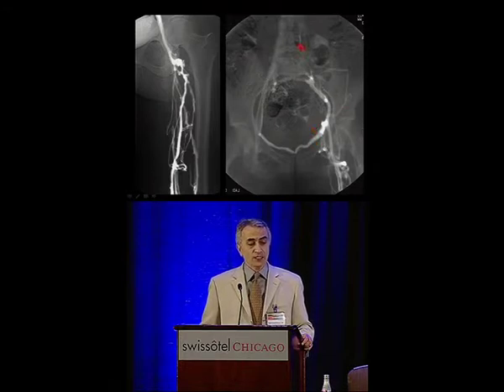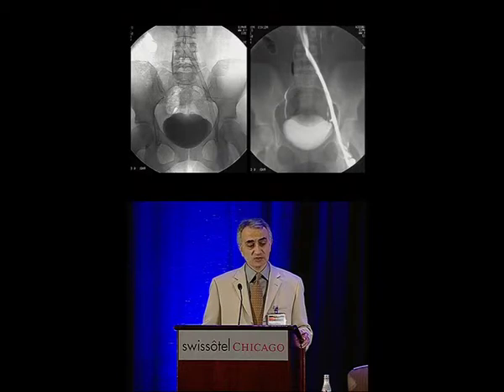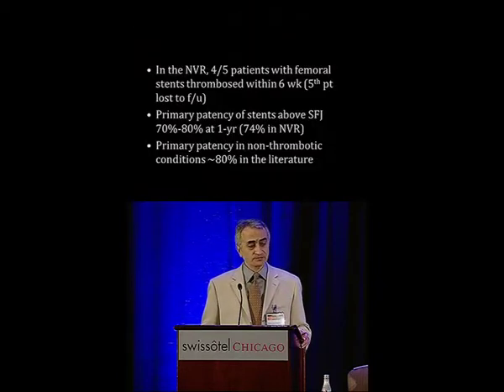Now, I treat these patients and recanalize the iliac into some place down here where there's good inflow to make sure that you have good patency. Typically, I do not stent the femoral vein for reasons that I mentioned, and you establish good flow. This is not a cure. These patients will continue to have some symptoms because of the femoral, but the magnitude of the symptoms improves.